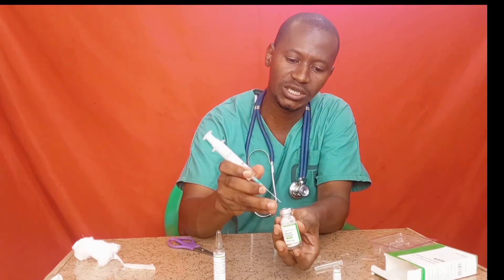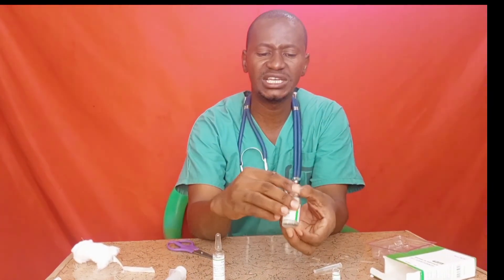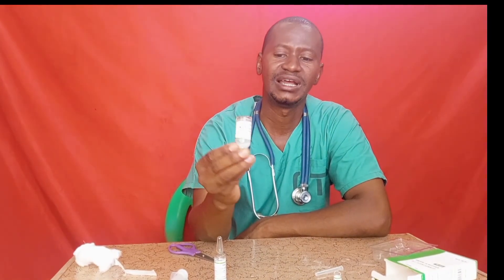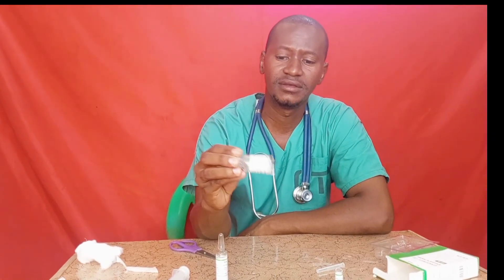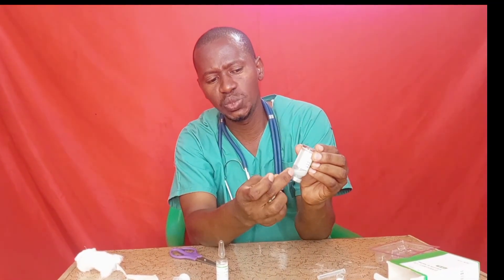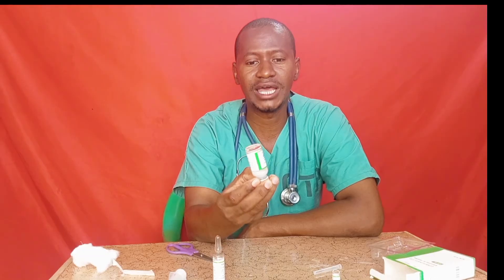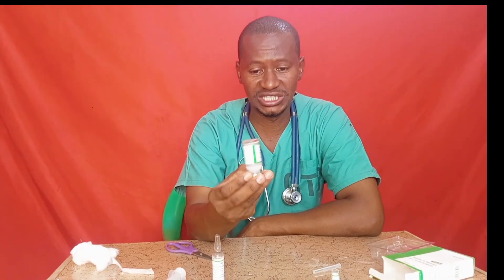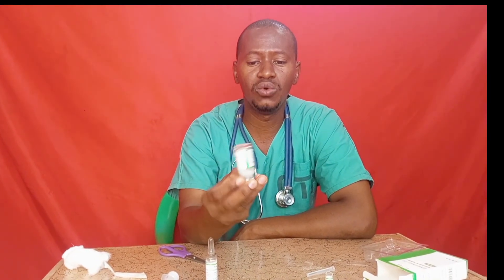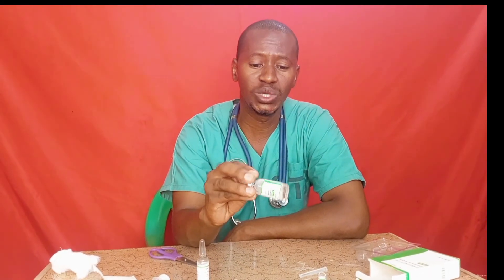Withdraw the 2 ml of sodium bicarbonate and add it into the vial. Then shake the vial gently. Allow the solution some time to dissolve — if you don't, it will form white particles like milk. Continue shaking gently until the solution becomes clear.